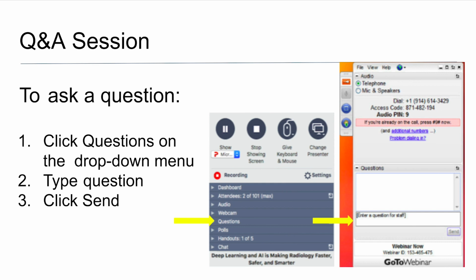Next question. Is the algorithm applied on the DICOM level or as a part of the image reconstruction? Yeah, I think there are opportunities in both the pre-DICOM and post-DICOM phase. And I think there are a lot more possibilities if we can do it before DICOM, because in the DICOM conversion, basically the reconstruction step, compresses a lot of information into the image, so some information is missing.